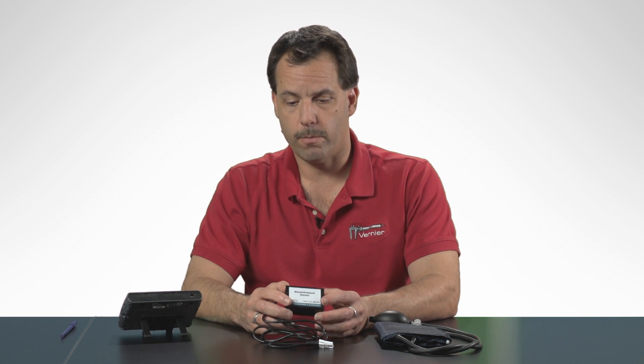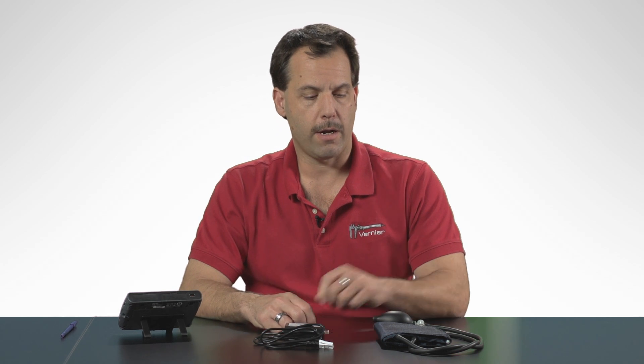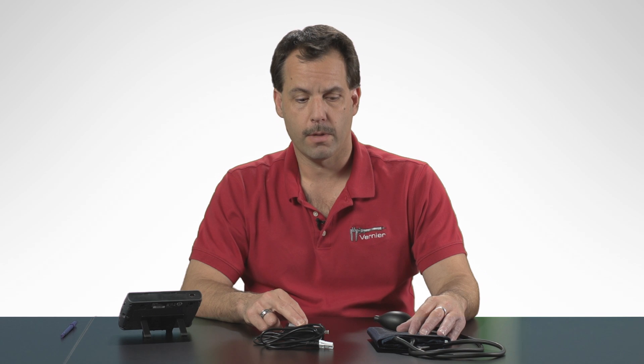The blood pressure sensor comes with a little sensor which gets plugged into the LabQuest 2, and it also comes with a cuff that is attached to the blood pressure sensor. The cuff has to be attached to the arm, left or right, and we're actually going to be measuring little pulses from the brachial artery in the arm to determine those parameters for blood pressure: systolic pressure, diastolic pressure, MAP, and pulse.